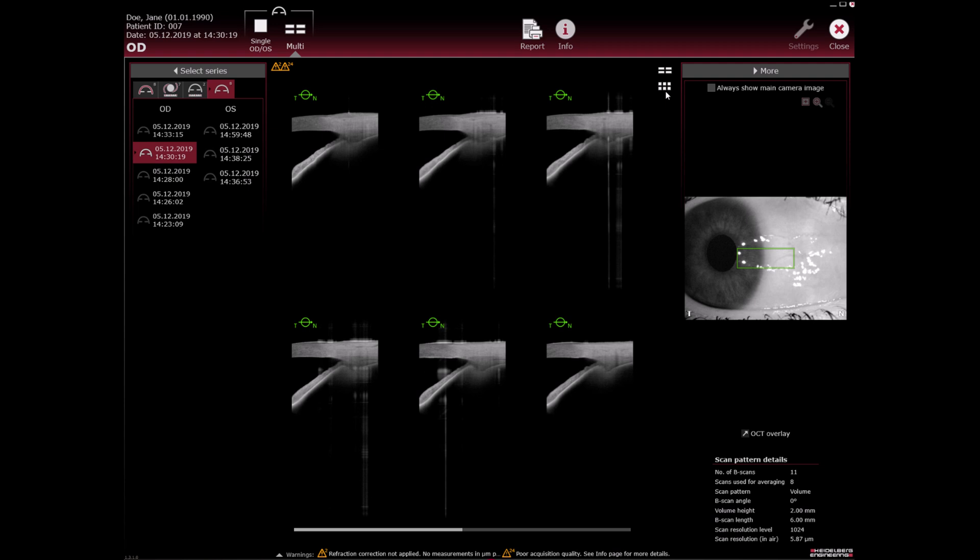Remember, you can hide the more section by clicking on the arrow symbol next to more.